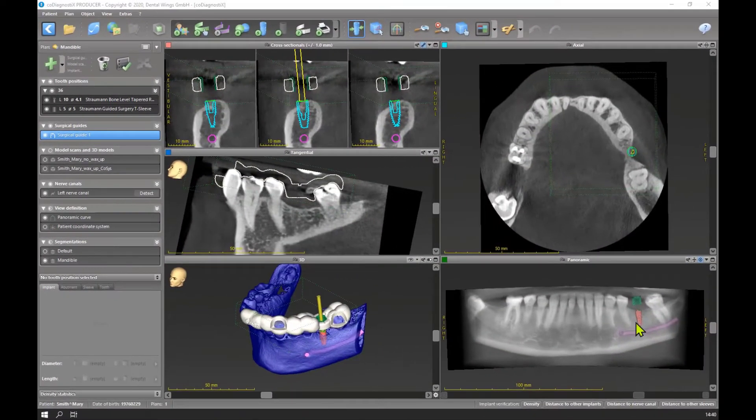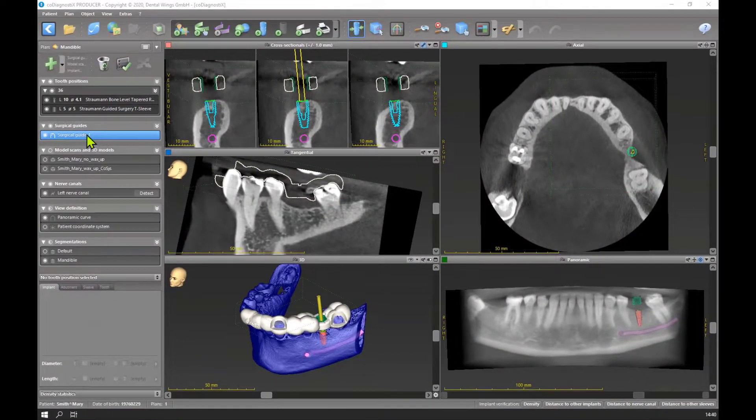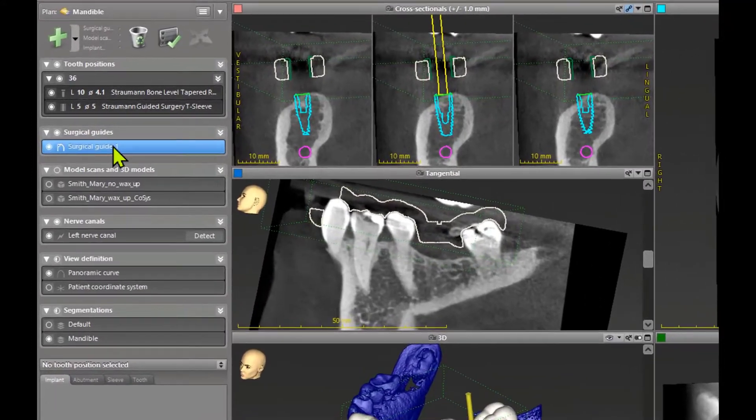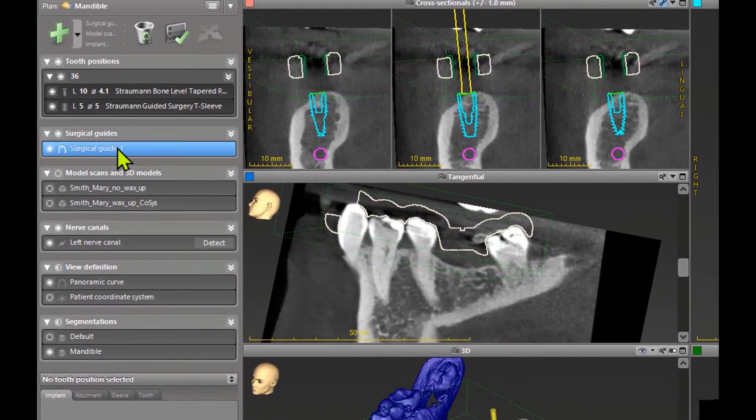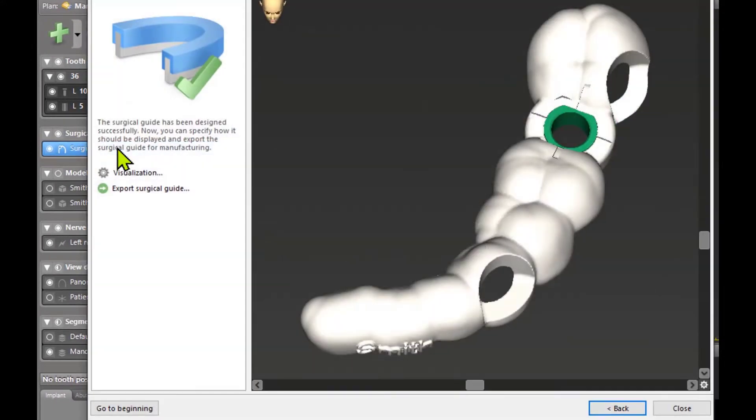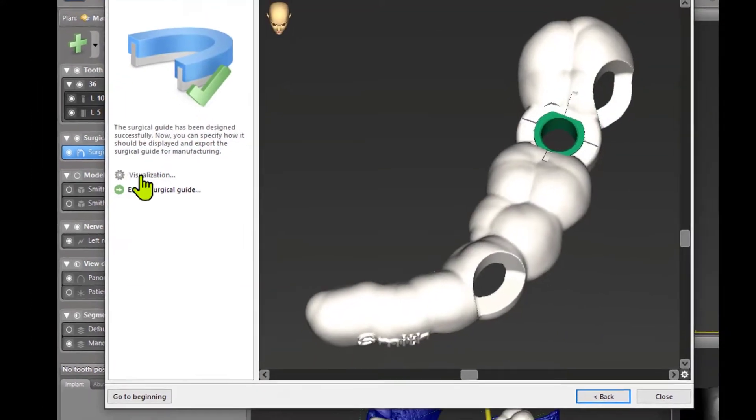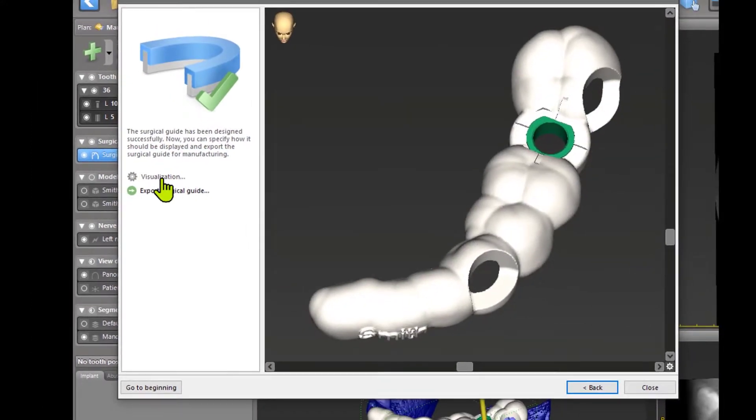This topic is not necessary for planning, but if you want to know a little bit more about your surgical guide, you can double-click on it and you see the visualization button.